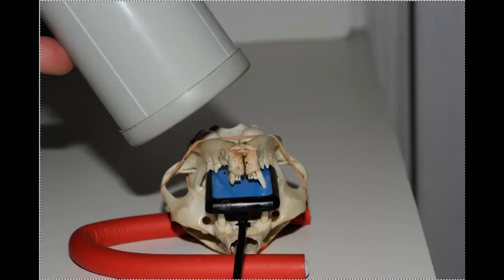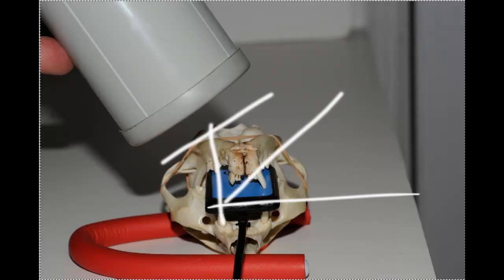Again, for the side teeth, pretty much the same. We're close to 90 degrees between the two. The teeth here being vertical since we're in dorsal recumbency. And the sensor being very close to horizontal and that bisect being something like so.